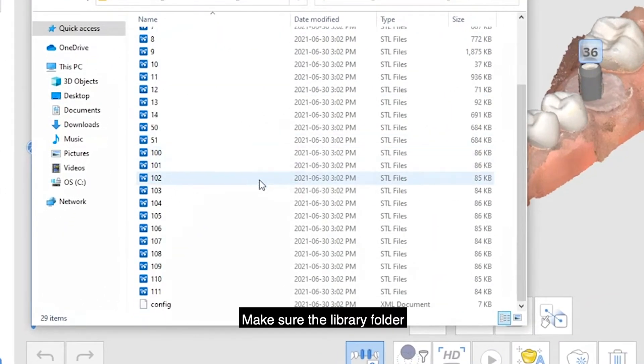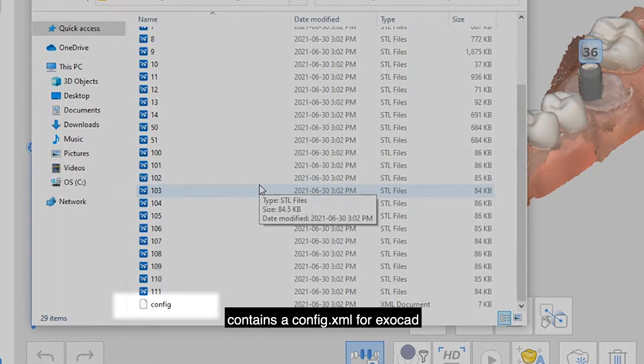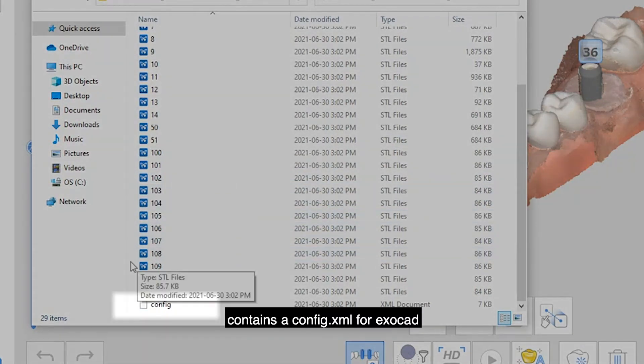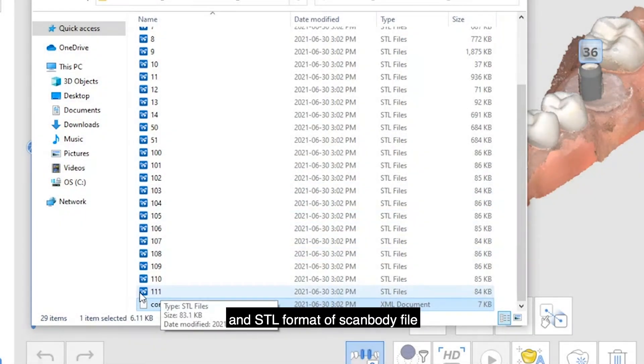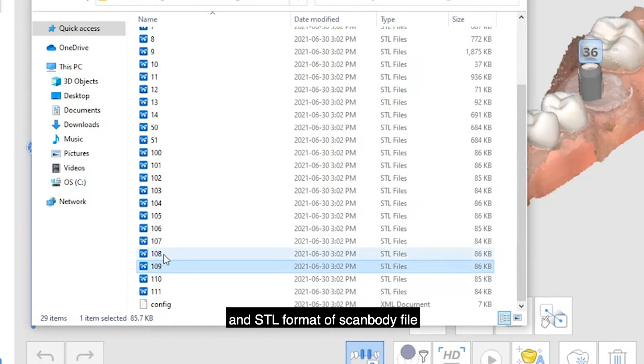Make sure the library folder contains a config XML for ExoCAD and STL format of ScanBody file.